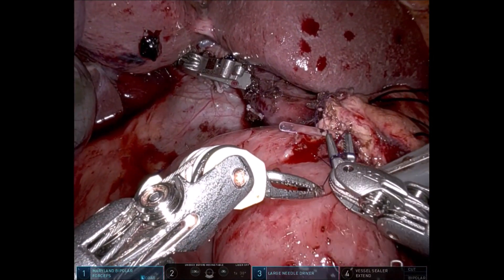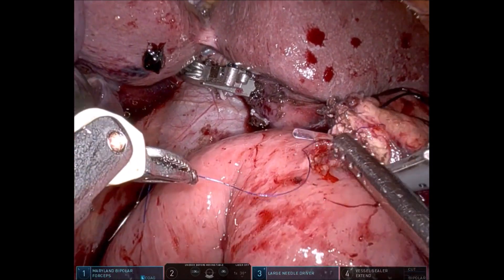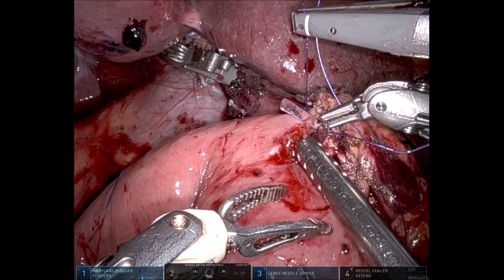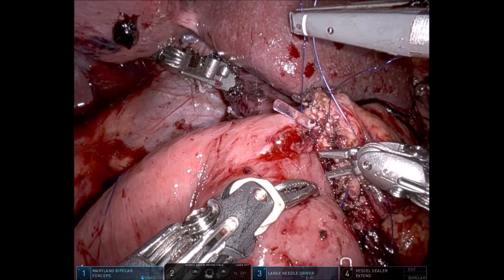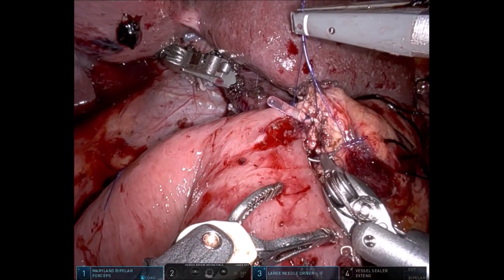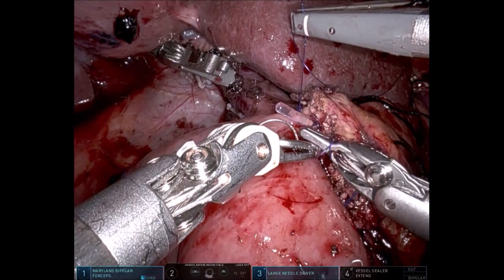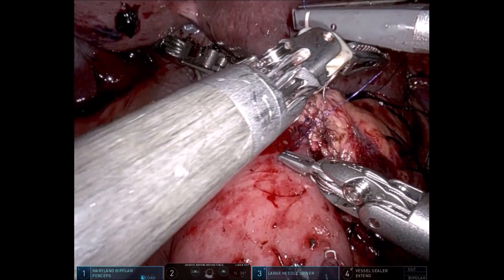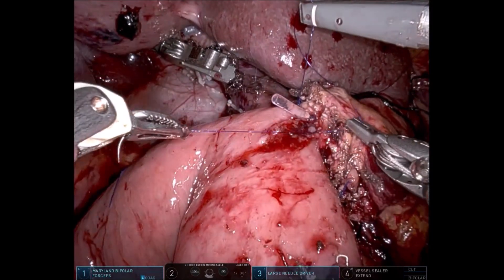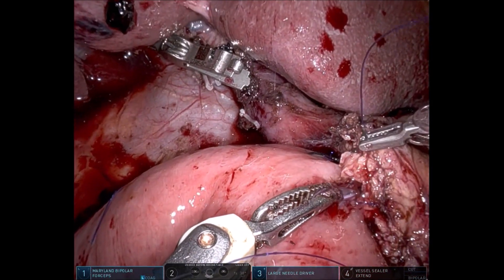The maneuverability of the needle holder and the 10-times enlarged vision at the console enables us to perform very good duct-to-mucosa suturing. The final posterior layer suture is taken at the 4 to 5 o'clock position. Posterior layer sutures are taken in-out of the pancreatic duct and out-in of the jejunum, and tied on themselves. Usually we do this with 5-0 PDS; since it is PDS we throw 5 to 6 throws, but for educational purposes we show just two throws here.